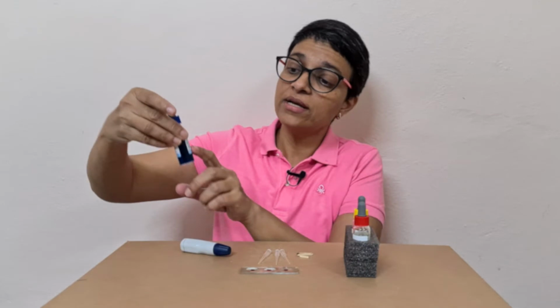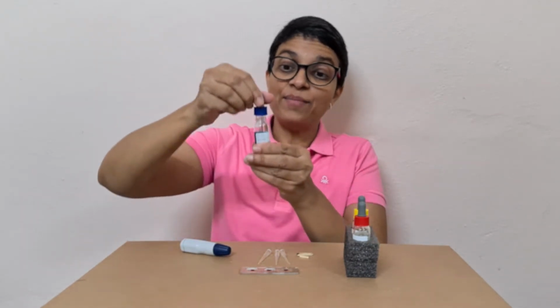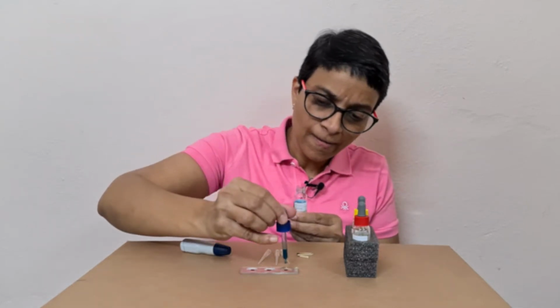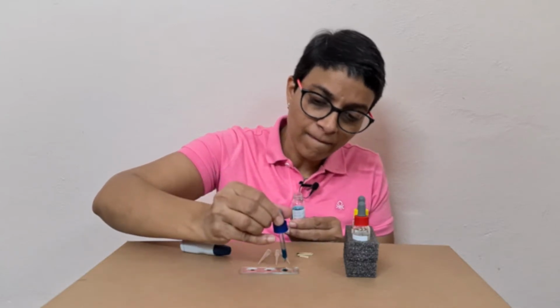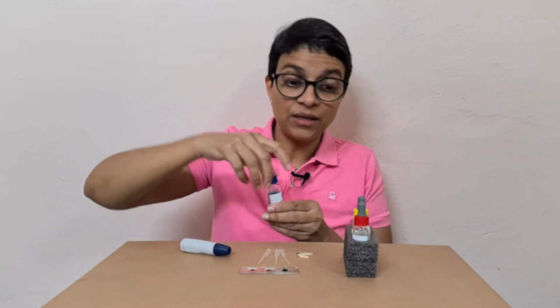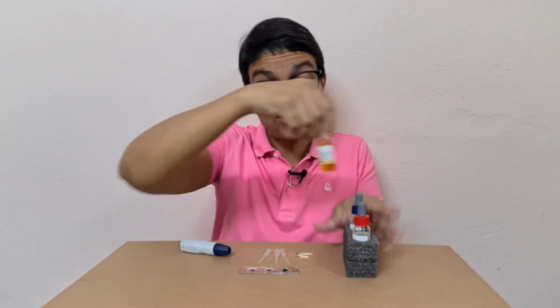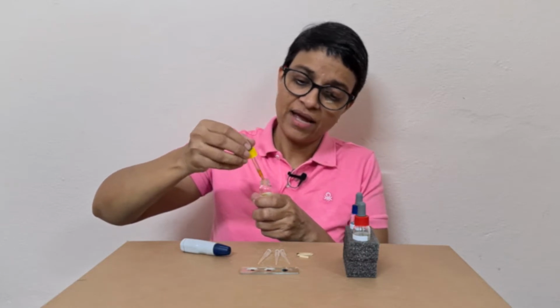So in the first one, I'm putting anti-A. That is, if I am A, I'm adding antibody A. 1 drop is enough. Antibody A I added. Now, if my blood has antigen A, then this antibody A will react.